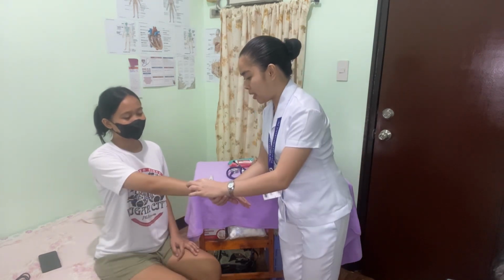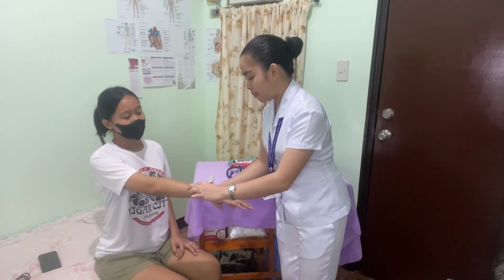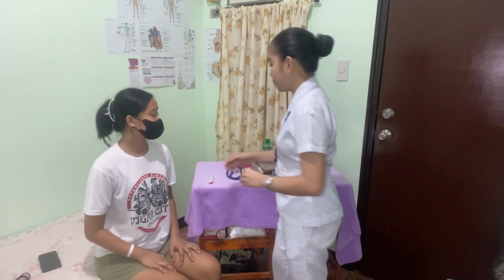Good day, ma'am. I'm Nikka Andrea as Pilas, your student nurse for today. Today, ma'am, I'm going to take your body temperature through your axillary side, or through your armpit. Is it okay with you, ma'am? May I see your wristband? Please state your name. Your birthday, please. July 16, 2000. Thank you so much, ma'am. May I pull your sleeve so that I can put the thermometer?